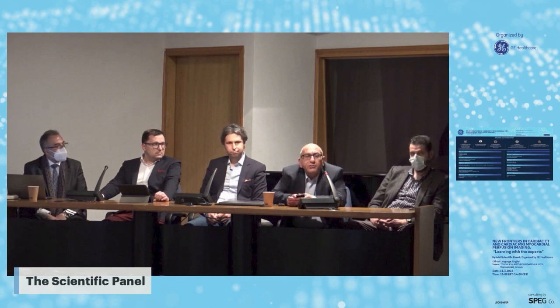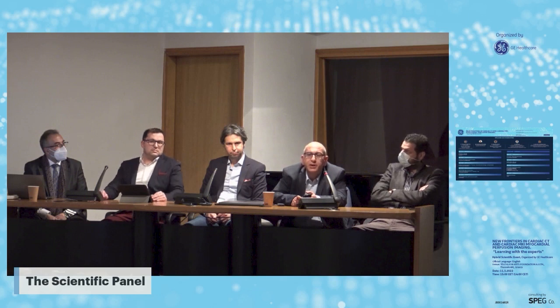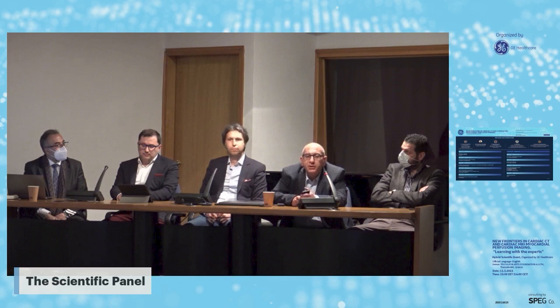The second thing I want to say concerning cardiac CT is that heart rate is the cornerstone of this whole process. So the people who perform the method have to know how to control the heart rate safely for the patient and be able to overcome any kind of mishaps or difficult situations. So in this case, it is very important.